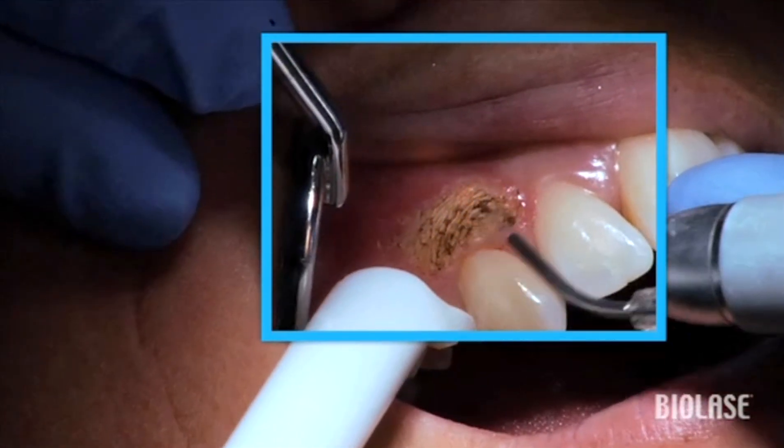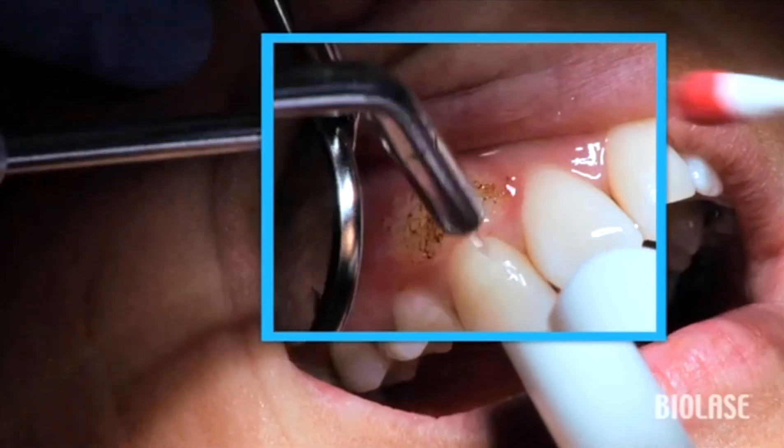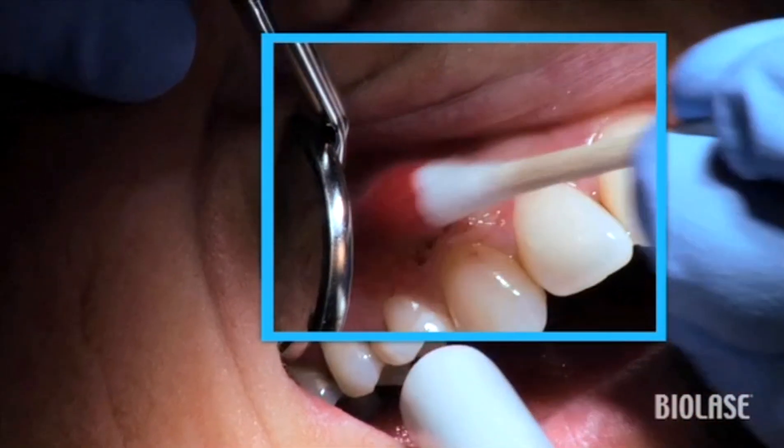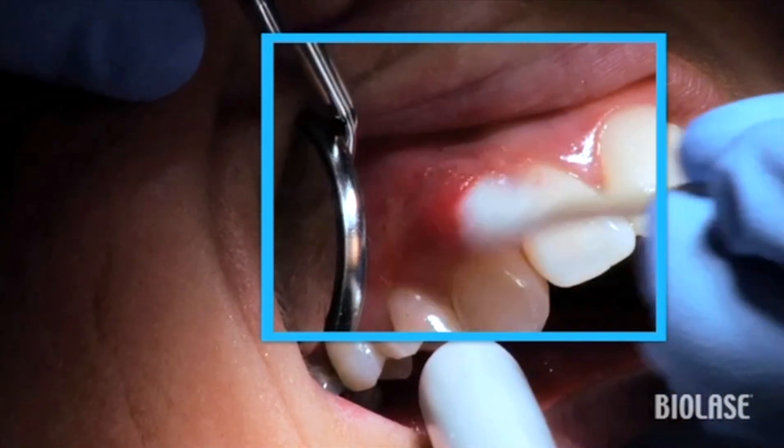Blend in the reduction in tissue to the outer borders of the excision site. If some of the tissue sticks to the excision site, take a cotton swab with some topical anesthetic on it and burnish the site.